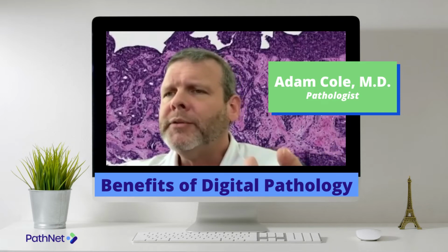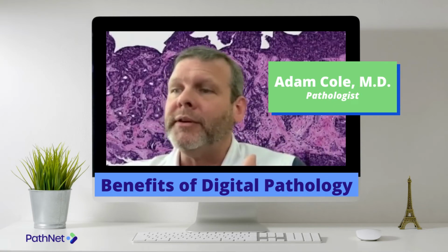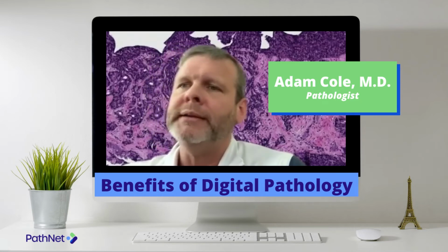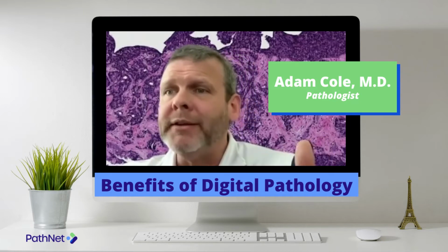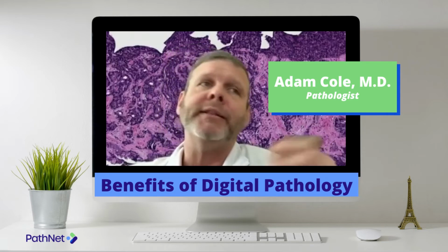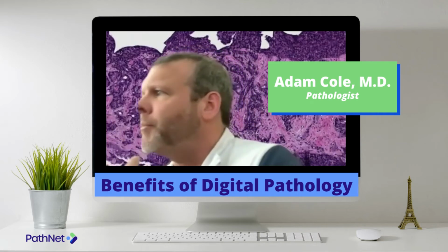important. So what you quickly realize is that in the traditional methodology, the vast majority of our time is spent identifying the case on your LIS, on your computer, saying, okay, there it is. Then you have to look down, find the slide that corresponds with that, and marry those two. You put that on the stage of the microscope, you focus, and spend very little time actually looking through it. I mean, the majority of this stuff kind of jumps out at you. You look at the tissue, then you have to take that off and put it back down in the separate container.